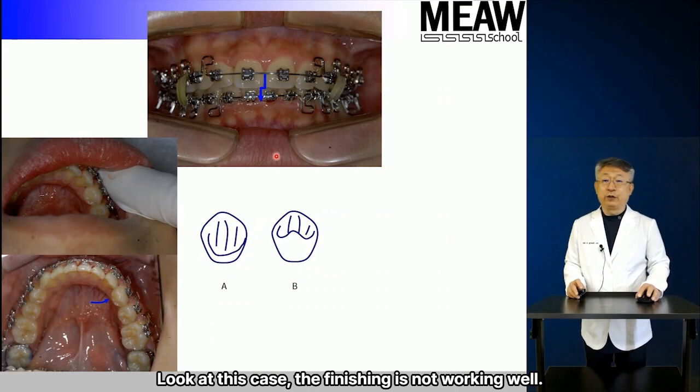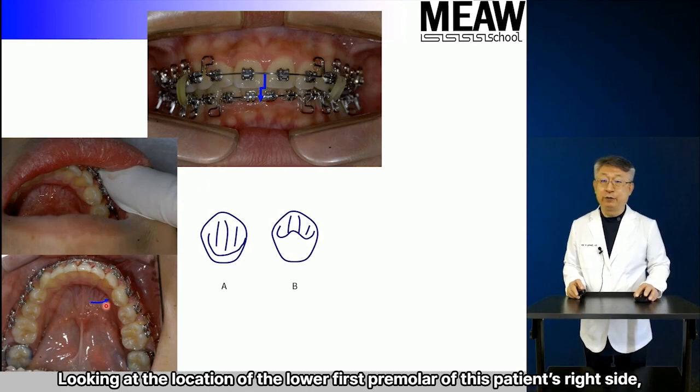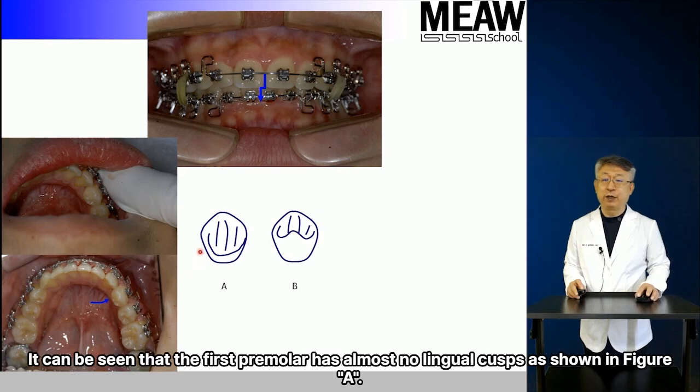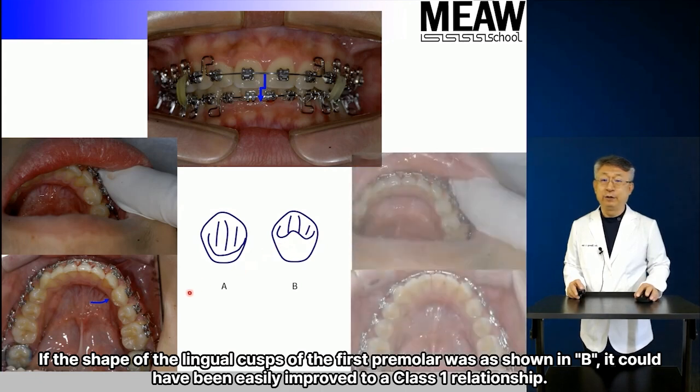Look at this case. The finishing is not working well. Why doesn't it work? You can see that the lower teeth are shifted to the right. Looking at the location of the lower first premolar of this patient's right side, it can be seen that the first premolar has almost no lingual cusps as shown in figure A. If the shape of the lingual cusps of the first premolar was as shown in B, it could have been easily improved to a class 1 relationship.